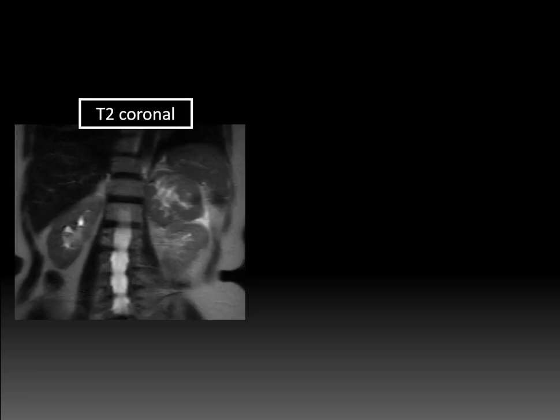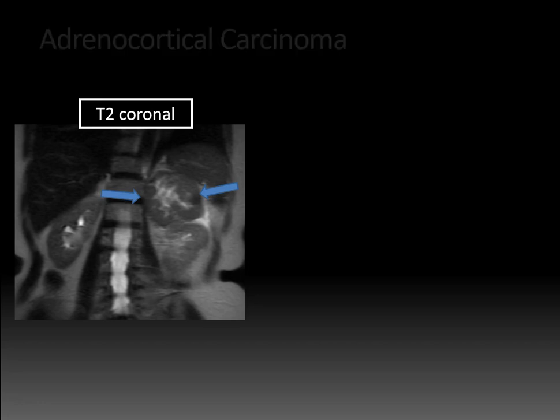On the T2 coronal image, you can again see the large size of the mass, superadjacent to the left kidney, with central T2 hyperintensity isointense to CSF in the spinal canal indicating necrosis. This was an adrenal cortical carcinoma.